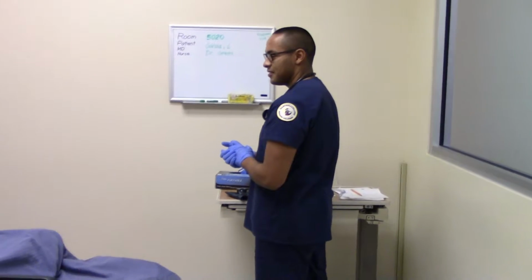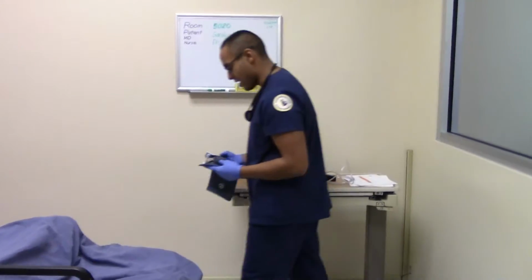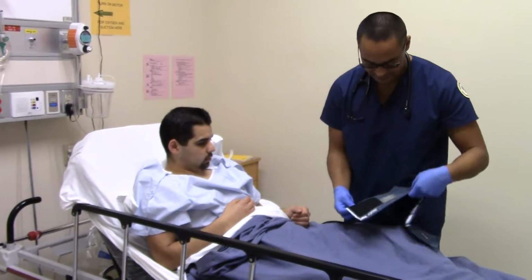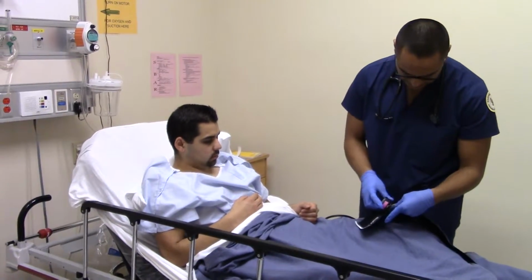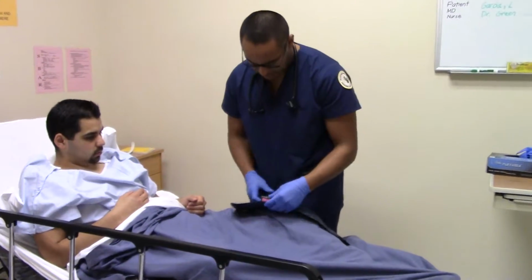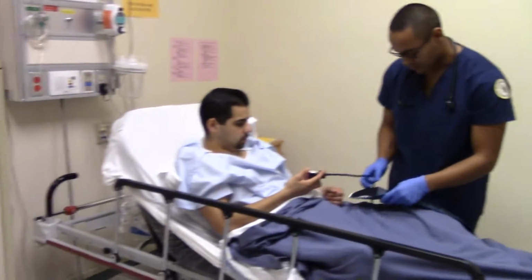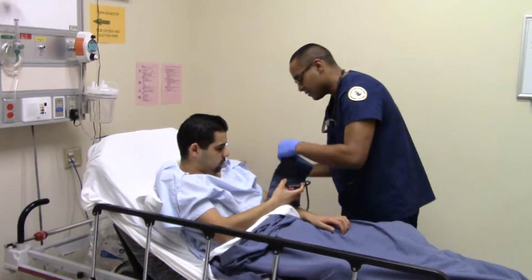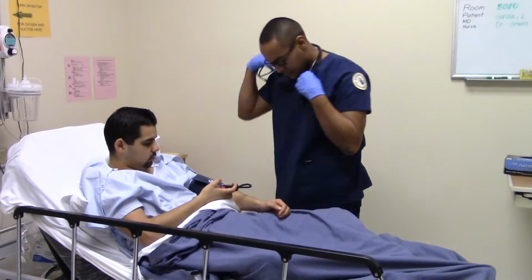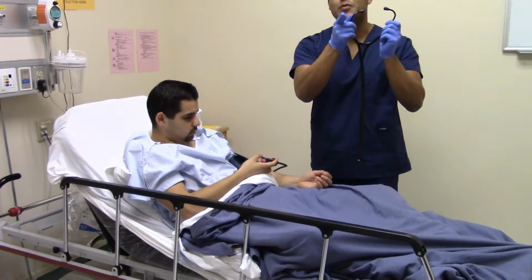Oh, okay, Chris, I'm going to go ahead and get your blood pressure, okay? You mind holding this up for me, please? Sure. Thank you. Oops, sorry. Warm up the stethoscope before you put it on the patient's skin.